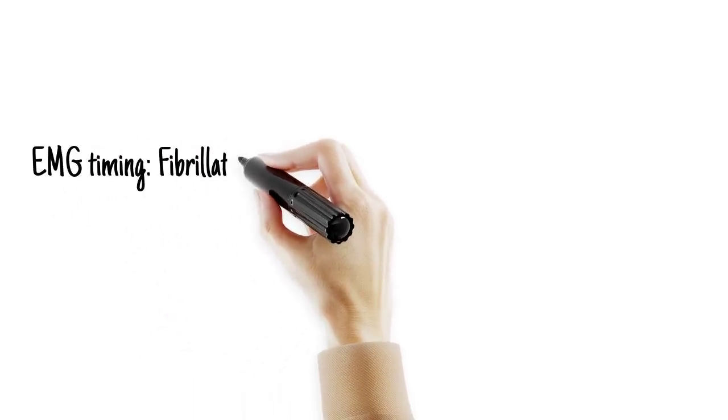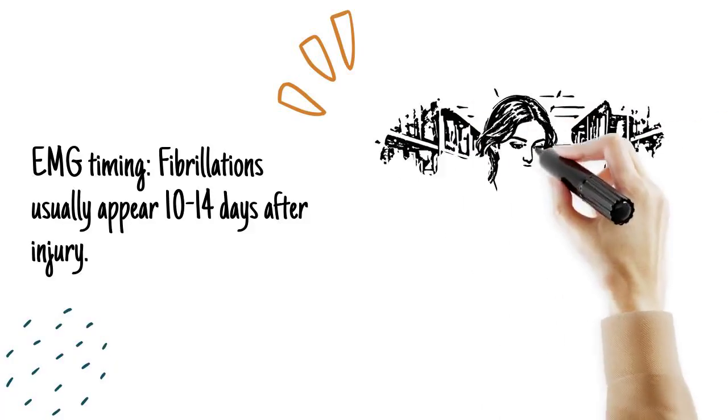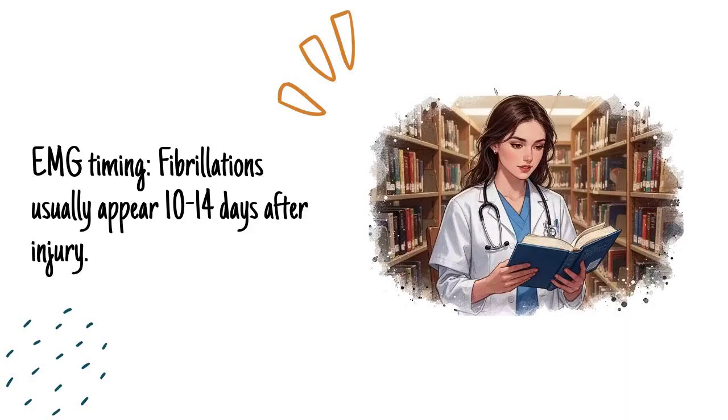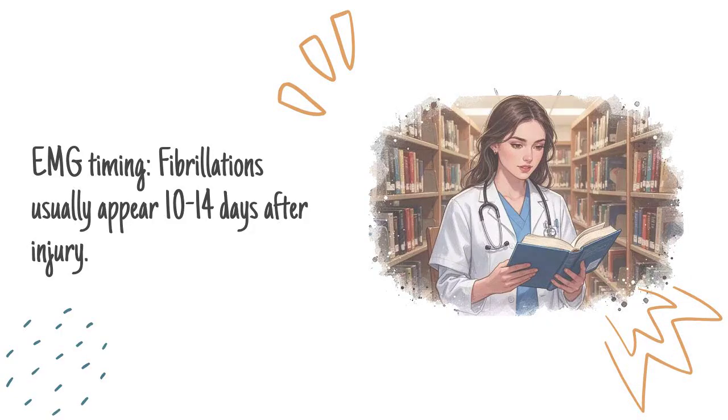After acute nerve injury, distal conduction may persist until Wallerian degeneration occurs over about 72 hours, while fibrillation potentials/positive sharp waves usually appear only after about 10 to 14 days. Some sources note a broader 1 to 4 week window depending on lesion to muscle distance.